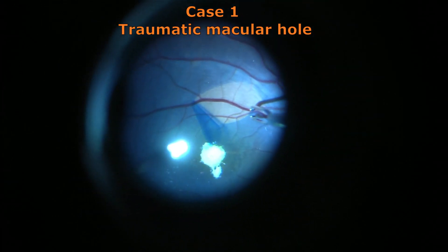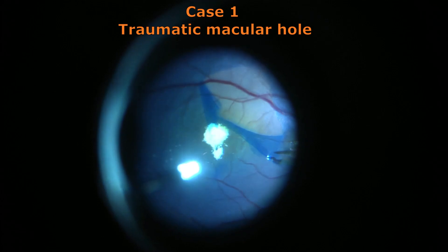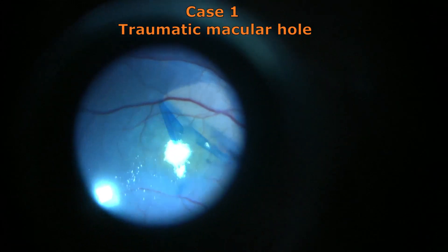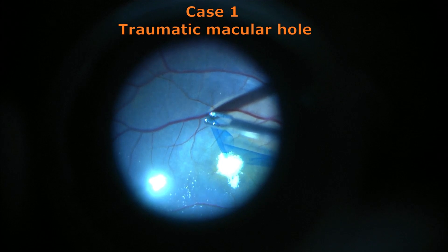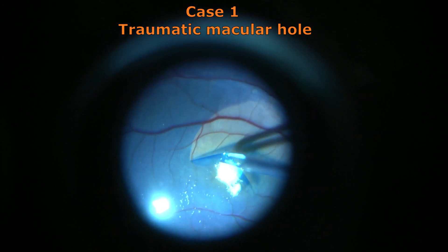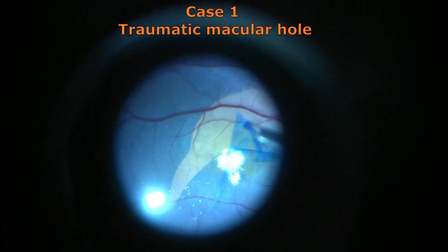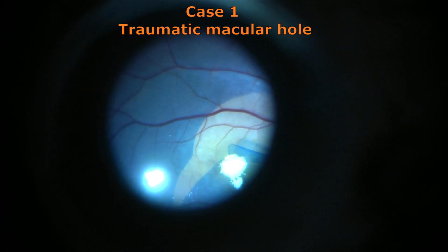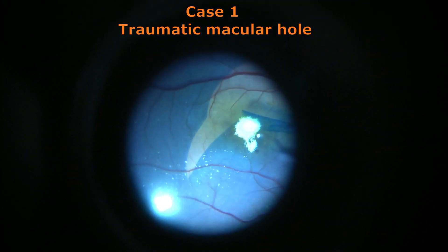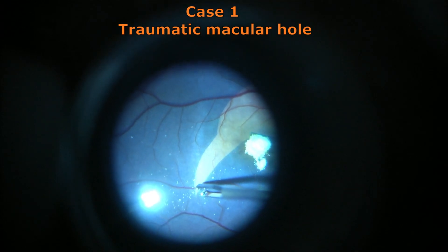The ILM behaves differently when compared to an anterior lens capsule, which is much thicker in consistency. This limiting membrane, because it is thinner and fragile, tends to break up frequently when compared to the anterior capsule of the crystalline lens. So one has to have a strategy. Here you can see that once the flap started to taper out, I extended the flap so as to have a nearly new edge to grab and proceed. I used this edge to raise another flap.